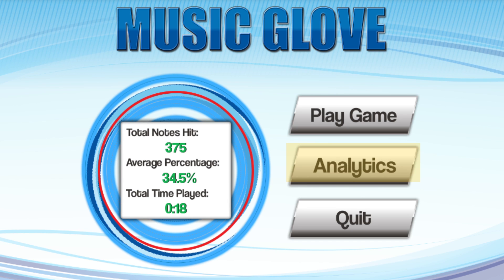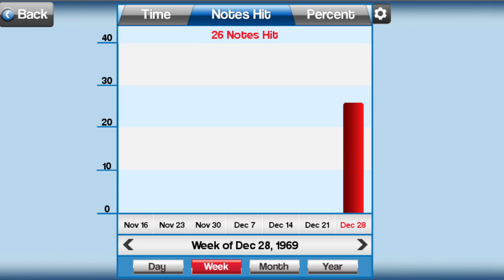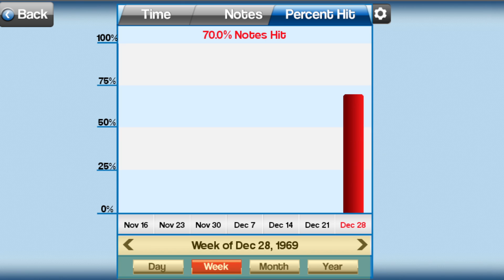When you finish your session, select Analytics in the main menu screen. The Analytics screen lets you track your progress over time. Select the tabs on top to change the metric displayed on the graph. You can view the amount of time you've spent playing songs, the total number of notes hit correctly, and the percentage of notes hit correctly out of the total number of notes presented. You can also view trends grouped over time.